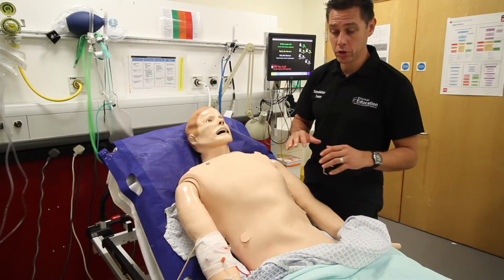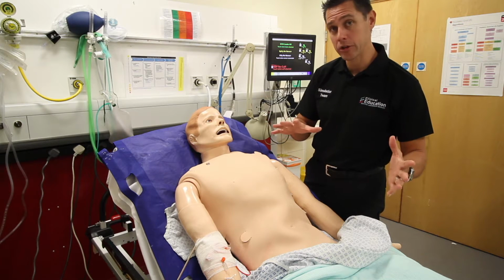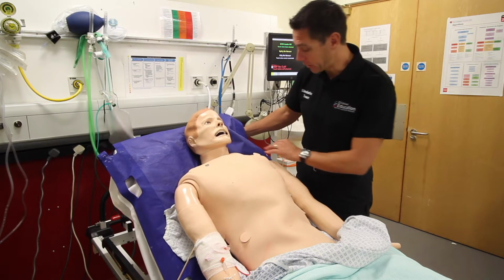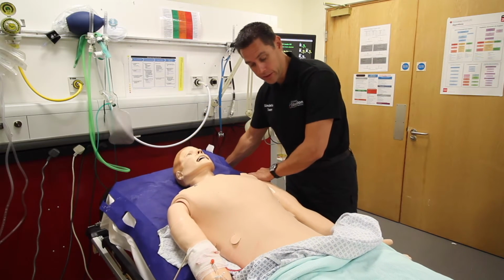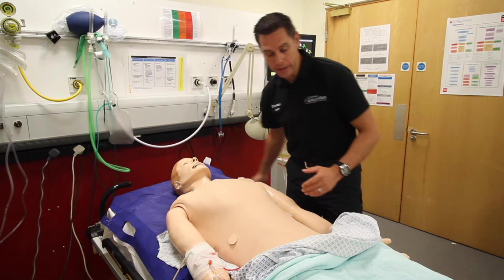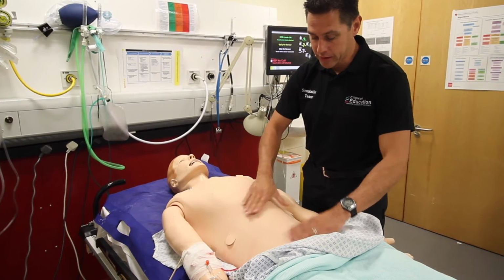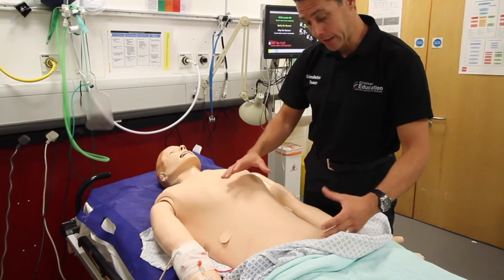So we'll just talk a little bit more about what other functions of the manikin there are. So I want to talk about his abdomen a little bit. So I'm just going to lay him flat. So Brian, I'm just going to lay you down for a second. We're just laying him flat, and you can see that, as he's a plastic mannequin, his abdomen is always going to be soft. It's never going to be rigid or distended, but it does have speakers in there.